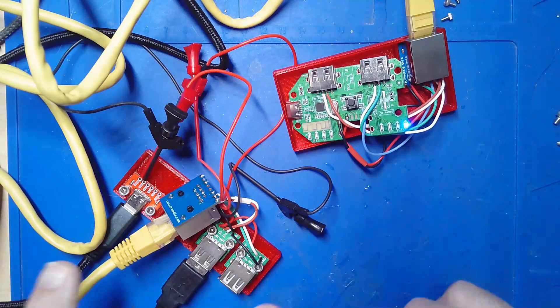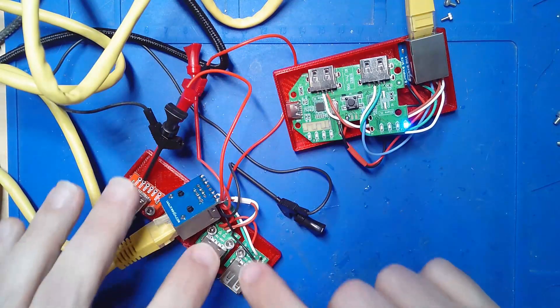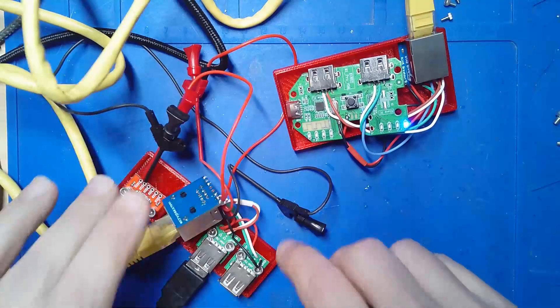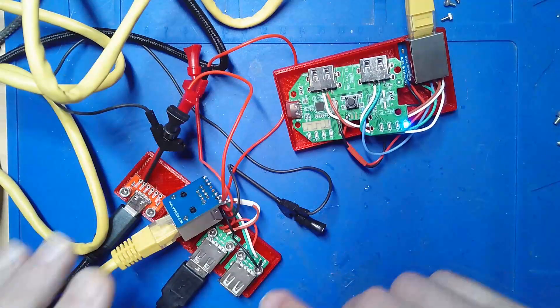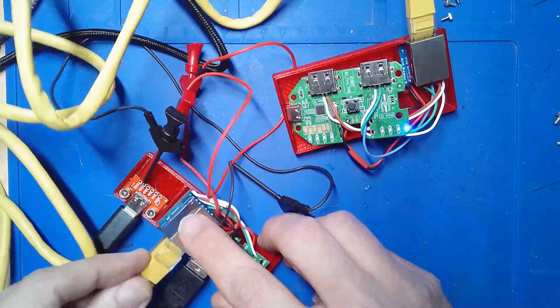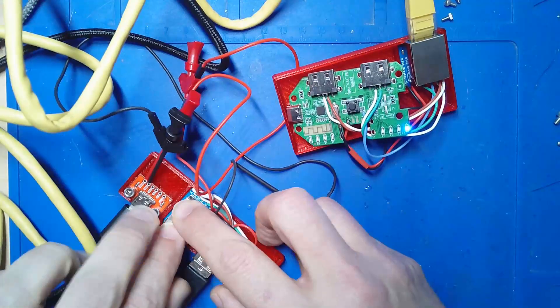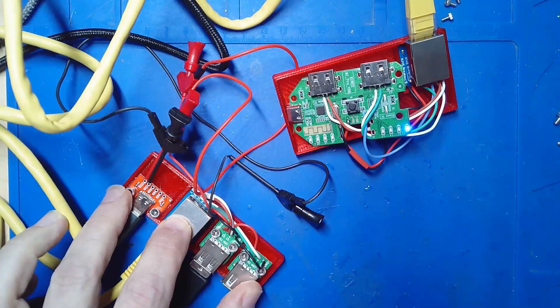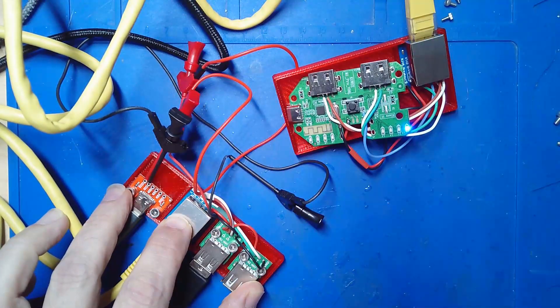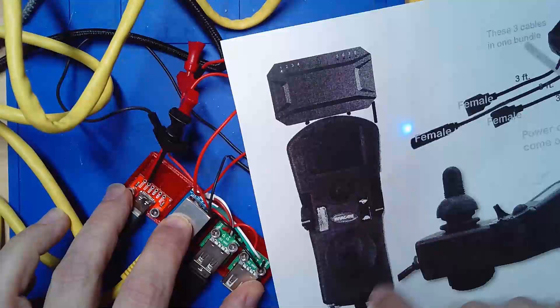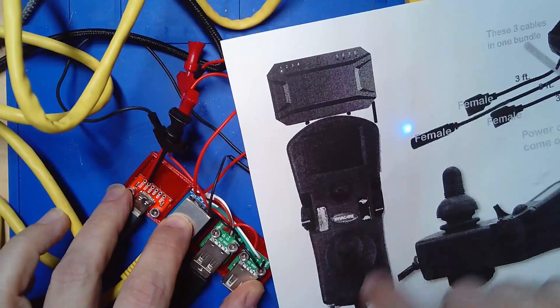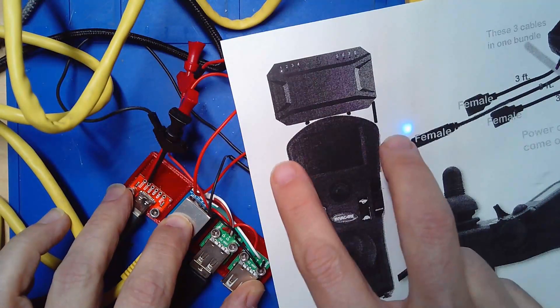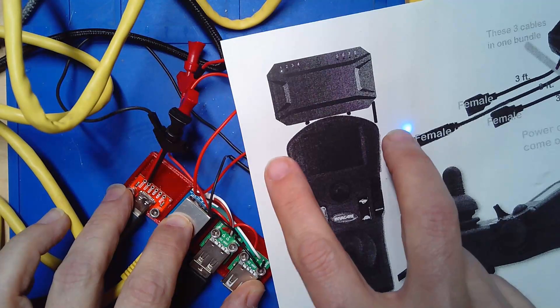So next up I'll be doing the jacks and getting that stuff wired. I'll have to redo this model a little bit to make space for them. It's always kind of tough trying to fit all these little eggs in one little basket as small as you can.